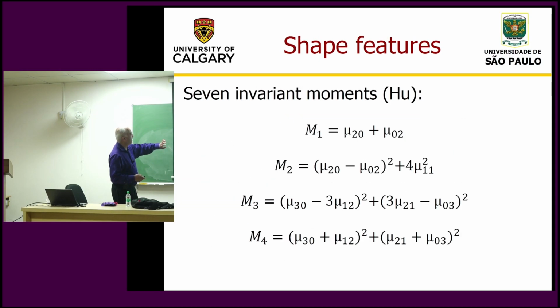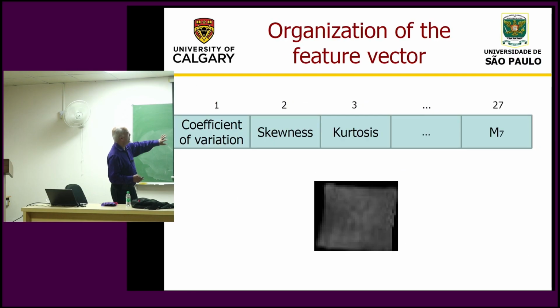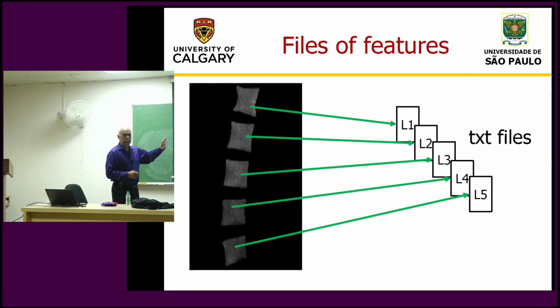Moments you have seen, I skip all of this, we have seen whose moments. These were all put in. So there is nothing new here except the Fourier descriptor perhaps. Fourier descriptors are not new, but the definition of that fraction of high frequency energy with respect to the total energy in the Fourier spectrum.